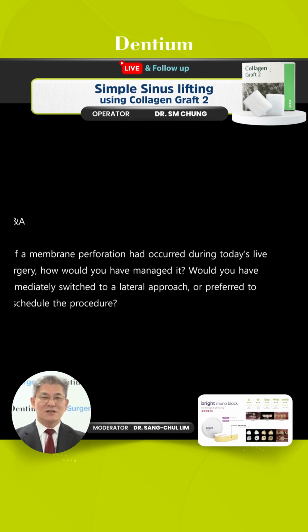However, another surgeon doesn't want any collagen matrix material, because a small perforation under 2 millimeters can be easily closed. Another reason is that if we use collagenated bone like Osteon 3 Collagen or Osteon Geno Collagen, this collagenated bone closes the small perforation area without any membrane application.